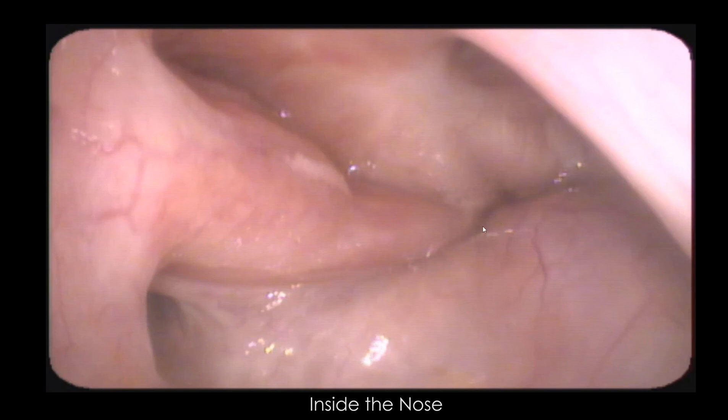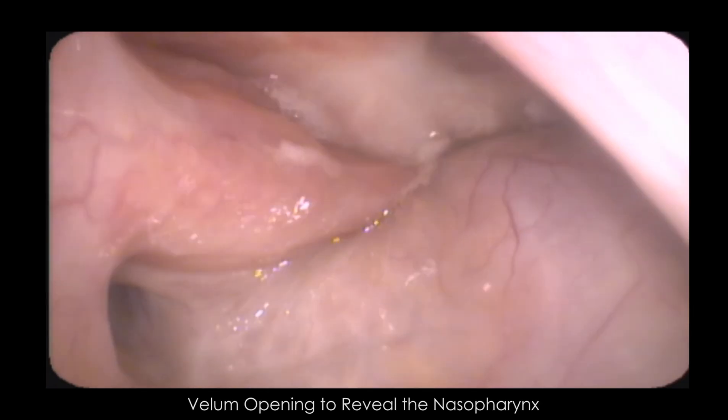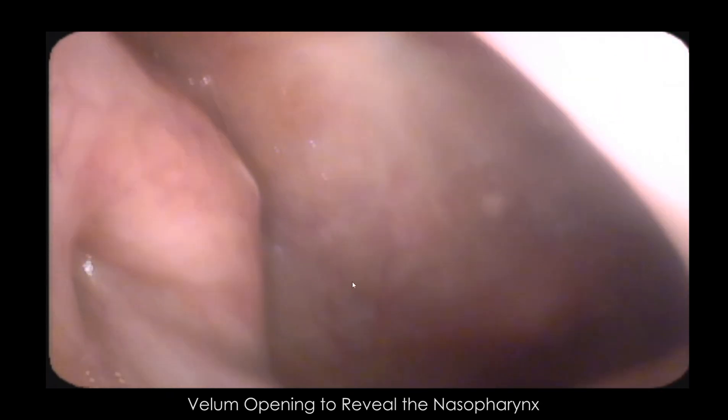This is my soft palate, or my velum. This is at the very back and top of my nose where your nasopharynx starts. And there we can see that the velum opens — the soft palate lowers — which opens up airflow into the nose. You always lower this when you breathe through your nose.